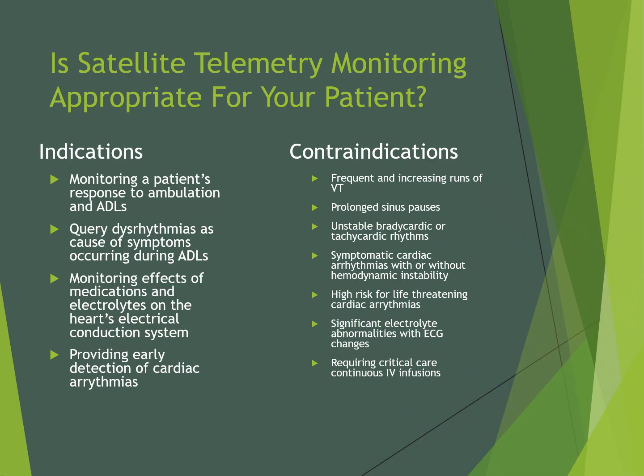If patients are experiencing anything from the list of contraindications, they should be admitted to a higher care area on a bedside monitor. It is important to note that there are no changes being made to the interventions we can provide on the medical unit. Therefore, you will need to refer to this IV manual for guidance on what medications can be administered on the floor or when the patient care would have to be escalated to receive appropriate interventions.